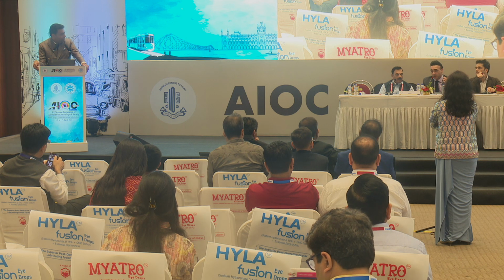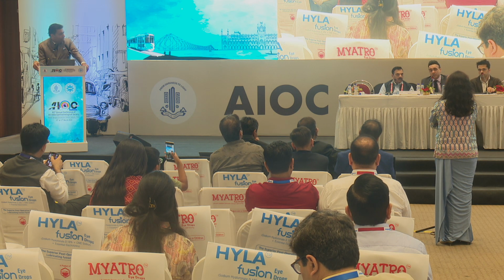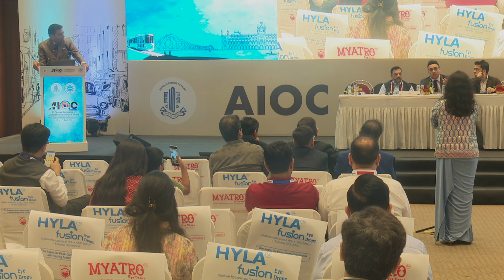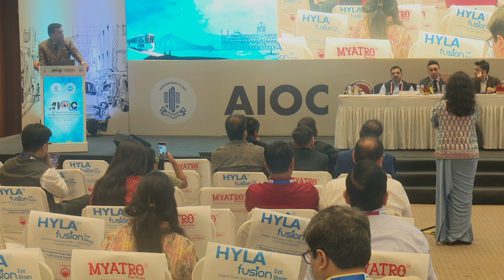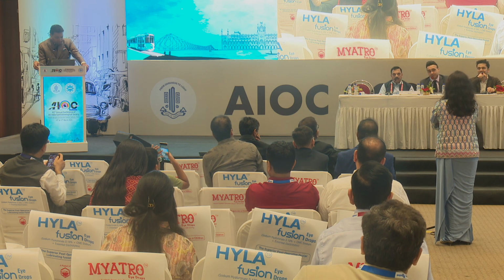And the evidence, to be frank, from first generation lenticule procedures against topography based systems is actually in favor of topography based systems. Now there are second generation procedures which should improve their outcomes. So hopefully somebody will do a study. I mean, everyone has LASIK machines, so maybe somebody here will do the study to answer that question. Thank you.